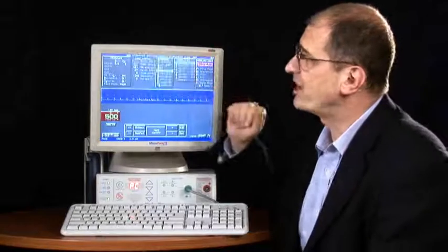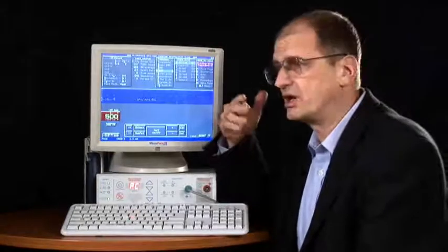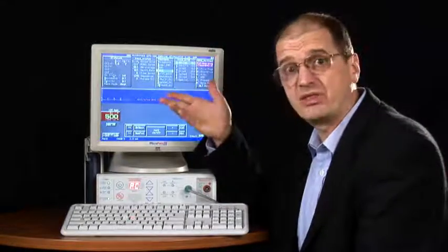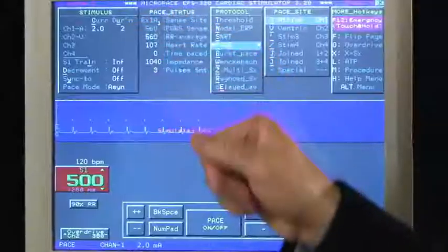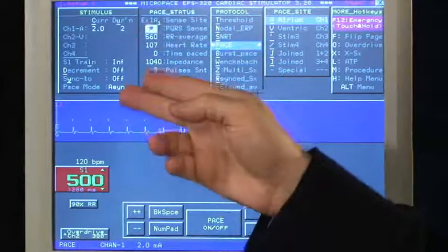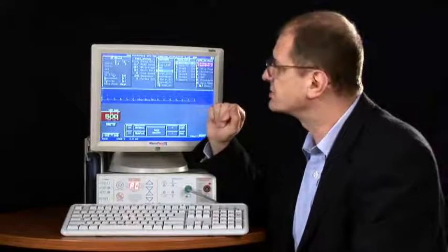Stimulus parameters include the current strength of the stimulus, the duration, and whether it is synchronized to the sensed ECG or not.